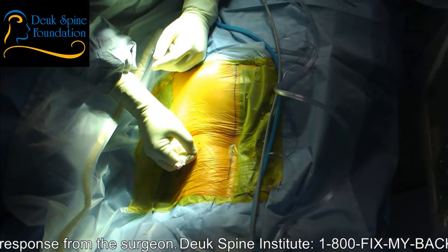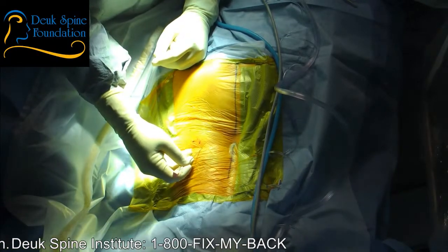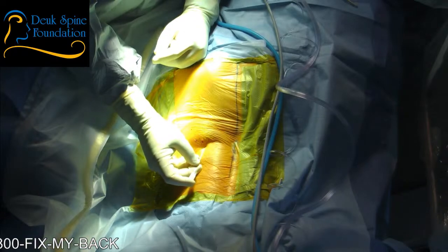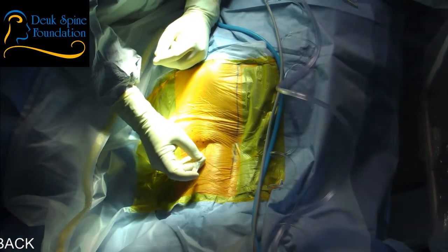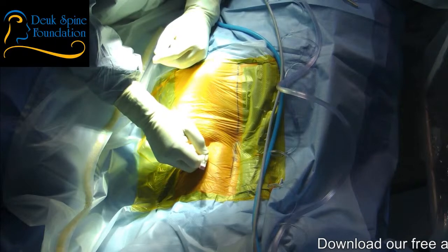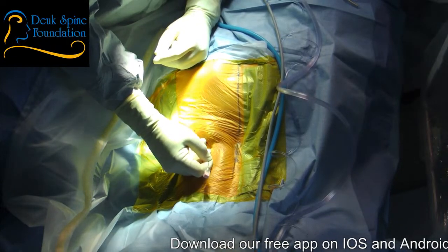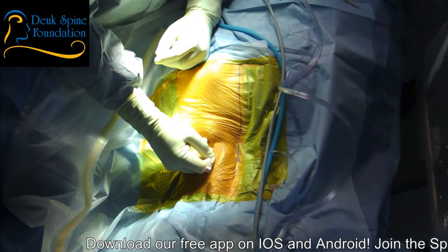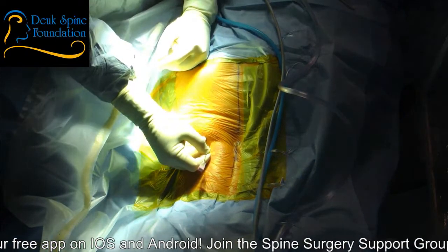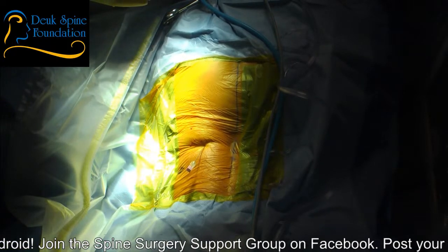Where do you feel that? Your back? We're nowhere near her nerves, so I'm not too worried about that yet. I'm sorry — this is the worst part of the surgery. I apologize. Do you feel anything there? That's it right there. Take another shot.